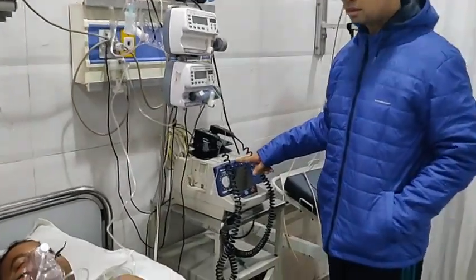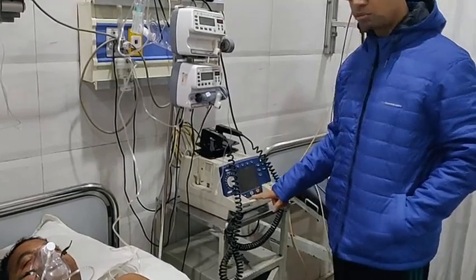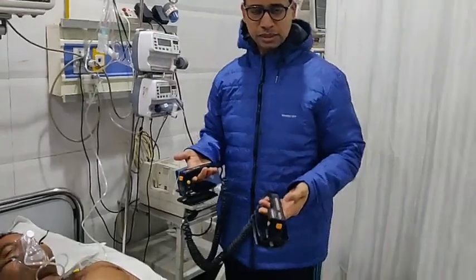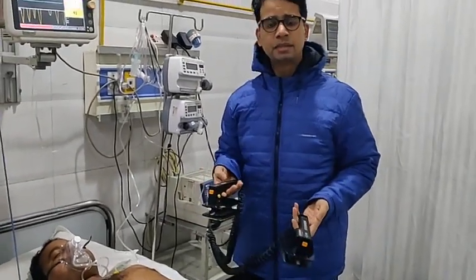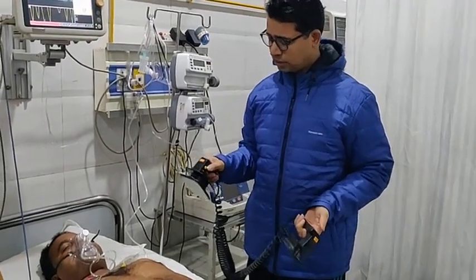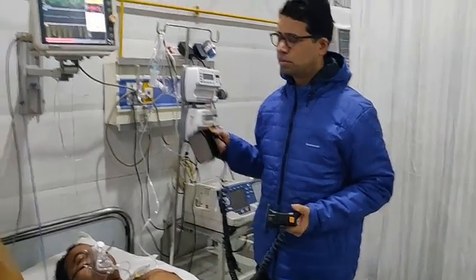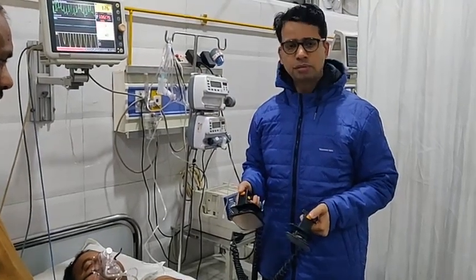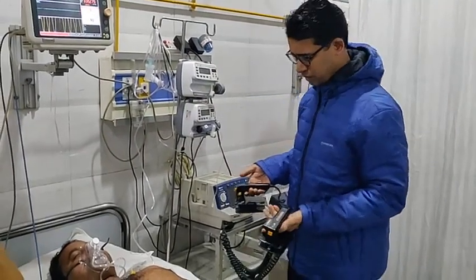Here you can see this is a Cardio Philips — a defibrillator from Philips. These are basically two paddles: one is to place just beside the sternum and another is just beside the apex. There is a yellow button with which we can synchronize it to the QRS complexes of the ECG, and here are the two orange buttons with which we can deliver the shock.